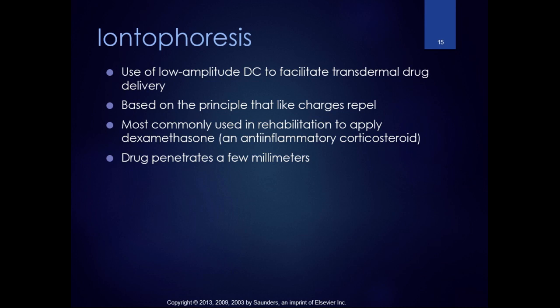All the other times I've done ionto, it's been with dexamethasone, which is an anti-inflammatory medication. The doctor prescribes that anti-inflammatory medication. At our clinic, we're part of the hospital, so we get it from the hospital pharmacy. At other clinics, I don't know where they get theirs, but your clinic will source that for you.